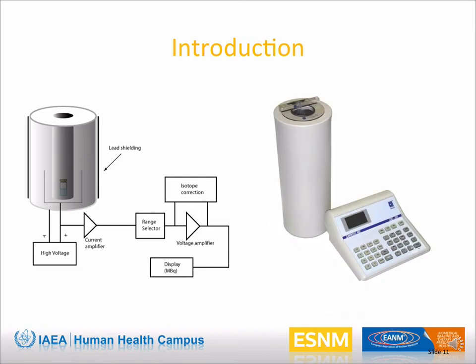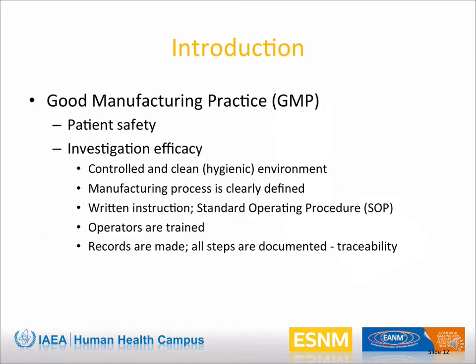This is how a commercial dose calibrator can look. And here you see the well where we put in the radiopharmaceutical. And this is the ionization chamber. And here is the display where you can read out how much radioactivity you have.